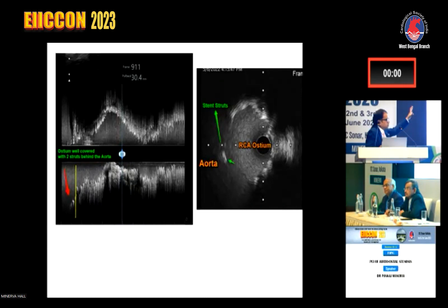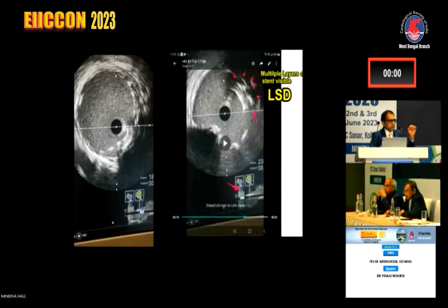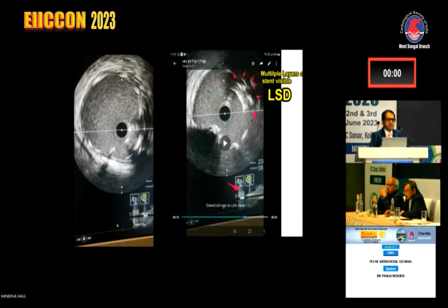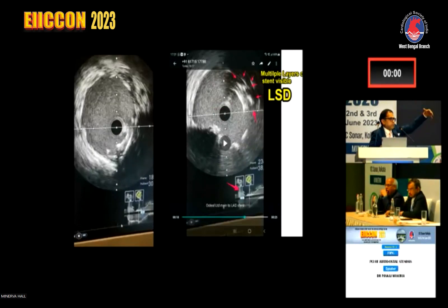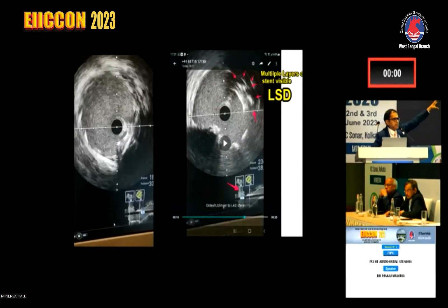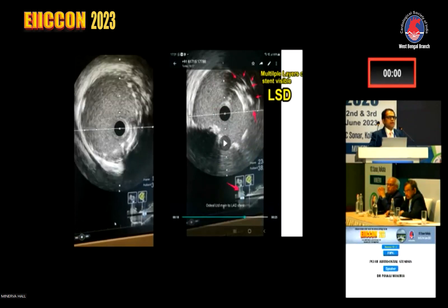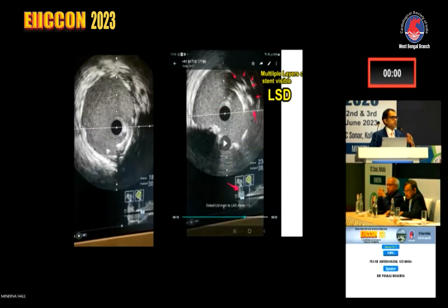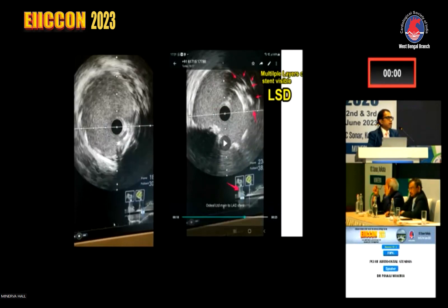This time we covered the ostium and confirmed with IVUS — we can clearly see the aorta and stent struts are behind the ostium. The second important aspect is to assess for longitudinal stent deformation in the aortic or hanging segment. On the final pullback, if you see multiple stent struts visible in the aorta at the ostial segment, that means there is longitudinal stent deformation — you need to rectify it. If you don't, it is a nidus for stent thrombosis and restenosis. This is a very important thing to look for whenever doing any aorto-ostial interventions.